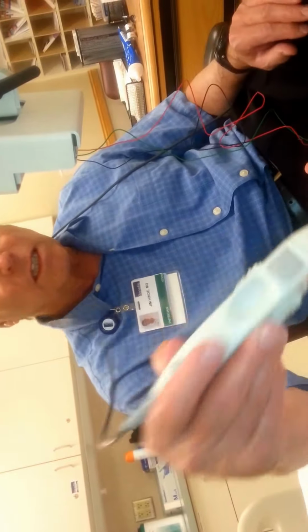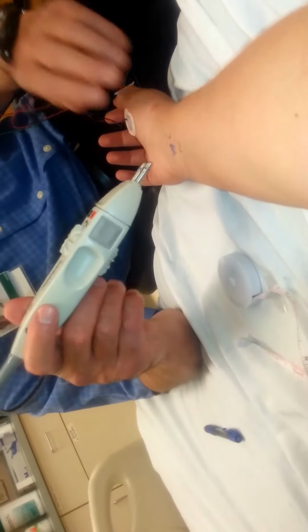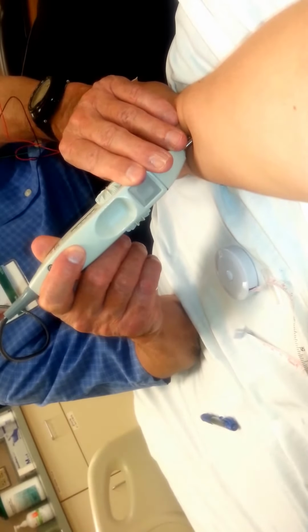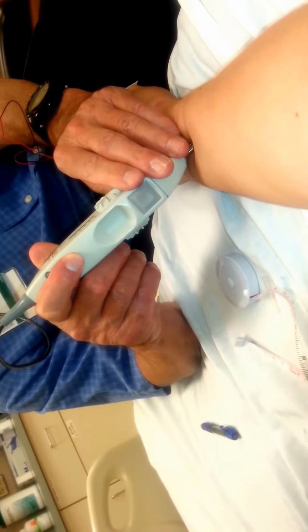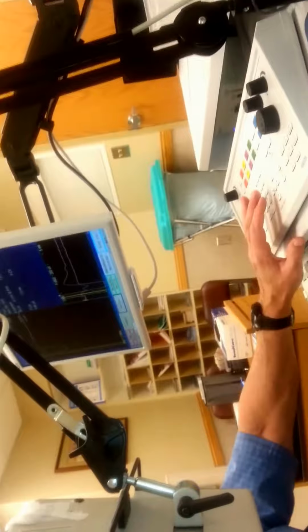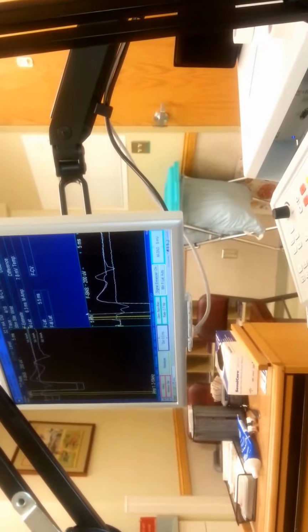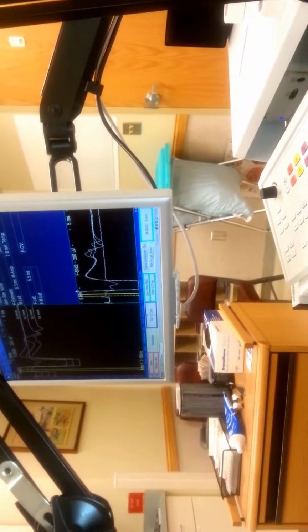Now we're going to send this clear up your arm to your spinal cord and your neck and watch it come back down and give us a second signal. Same size shock, nothing different. Okay, so that first wave on the line is traveling across the wrist. And here's the wave returning from the neck. That's called an F wave.